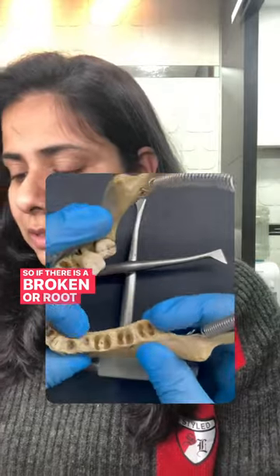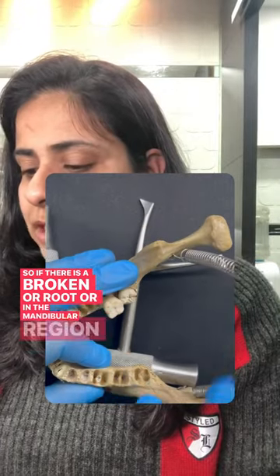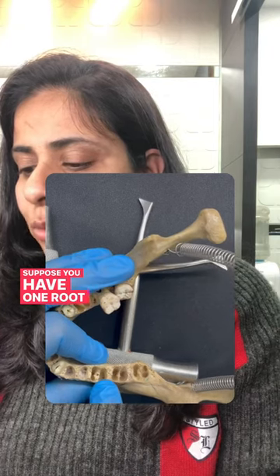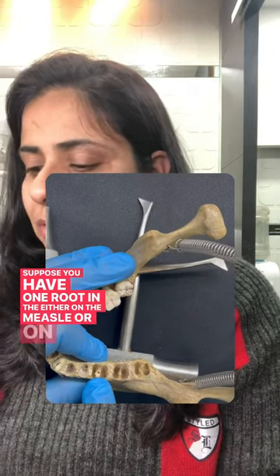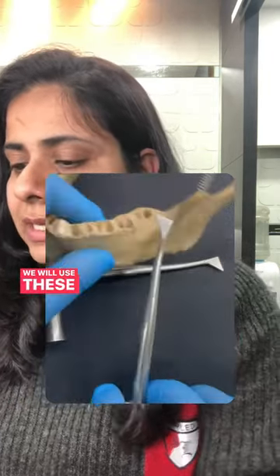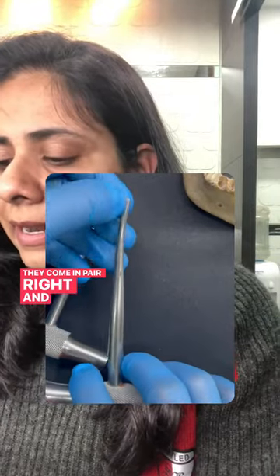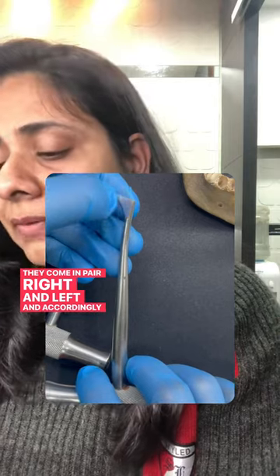So if there is a broken root in the mandibular region, there are two sockets — mesial and distal. If you have one root on either the mesial or the distal side, we will use these winter crossbar elevators. They come in pairs, right and left, and accordingly we will use them.